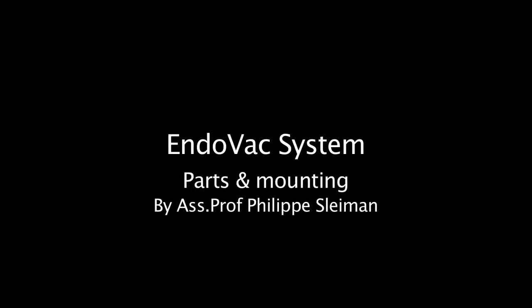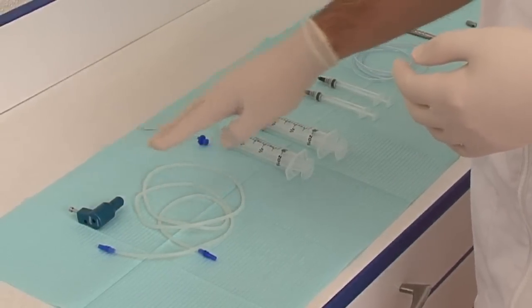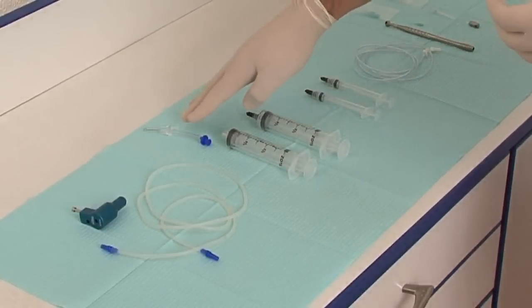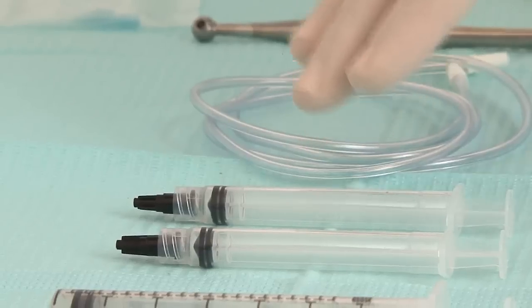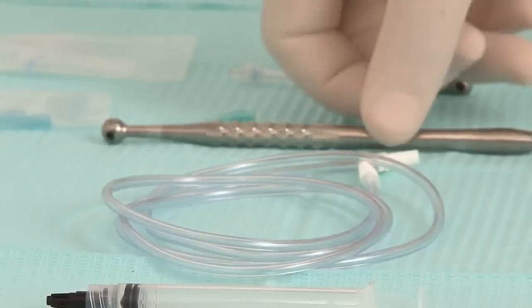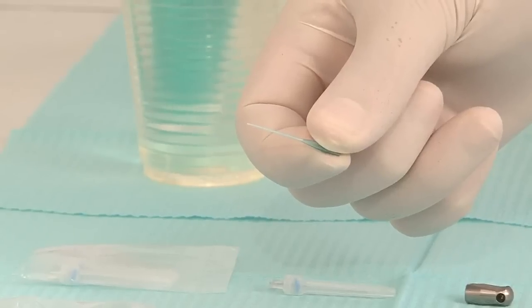Welcome to the EndoVac parts and mounting video. EndoVac is an irrigation system that creates internal negative pressure inside the root canal that allows a current of fresh irrigant in a continuous and safe way in the coronal, middle, and apical part of the root canal system. The different components of this system, we are going to see them and see how we're going to assemble them. This is the macro cannula.